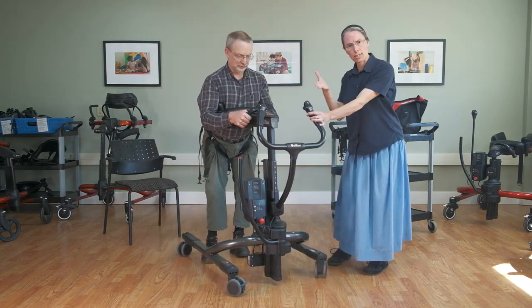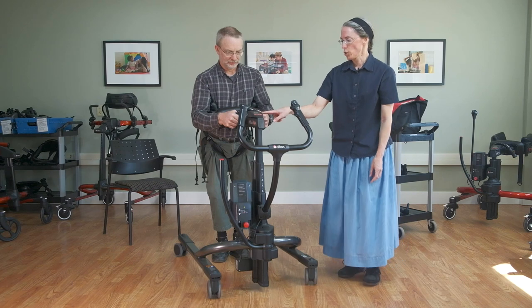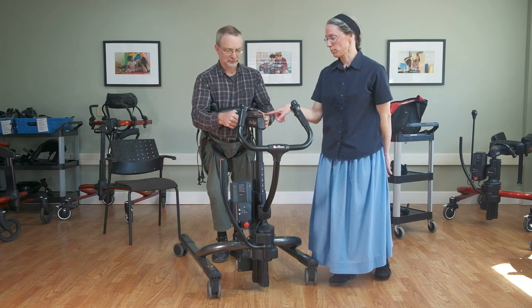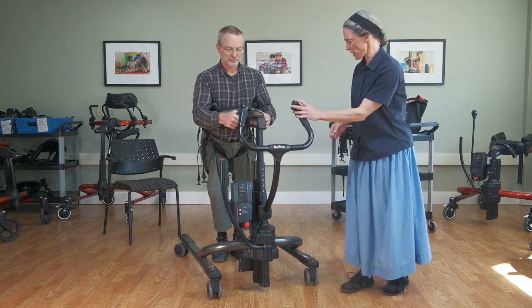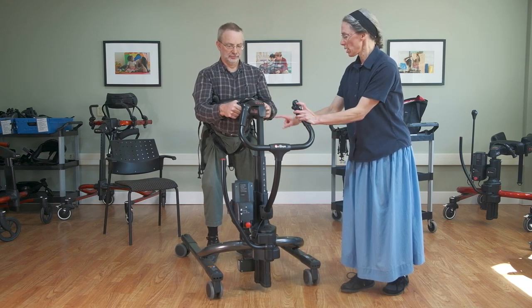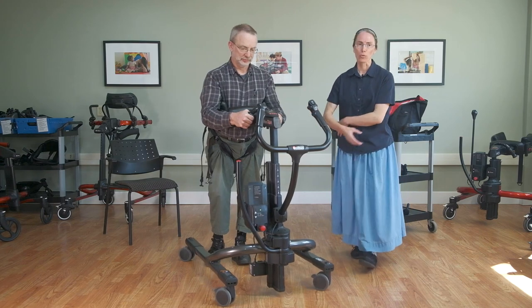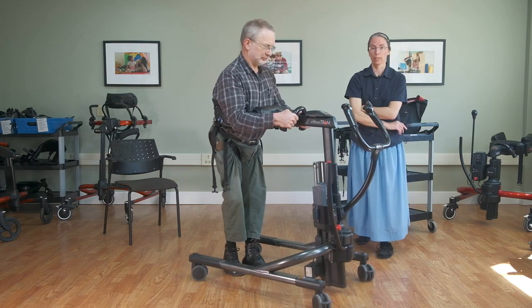He gets assistance to get into the standing position and we can use the scale to determine how much weight he's putting through the device — it becomes something of a weight-bearing assessment. With the student's permission I'll lift him off the ground momentarily and zero the scale. As I set him down, the negative number shown is the actual amount of weight he's putting through to the floor — the larger that number, the more weight bearing he's doing.